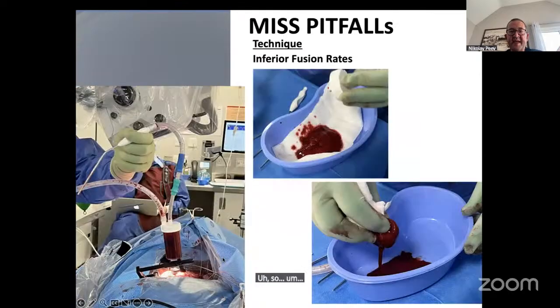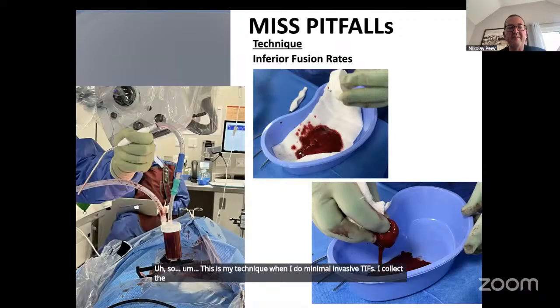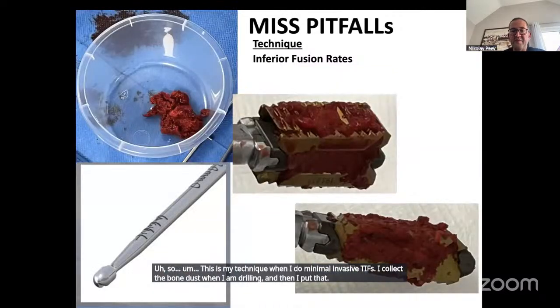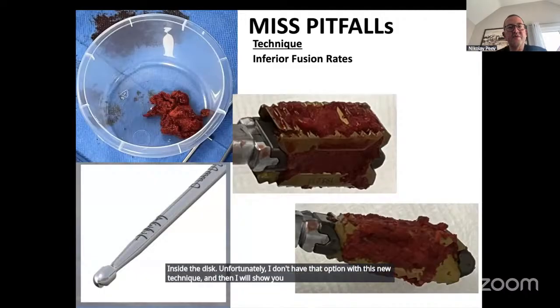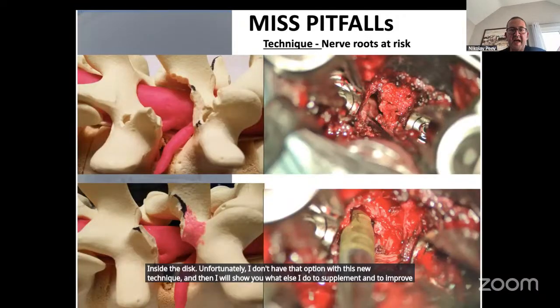This is my technique when I do minimal invasive TLIFs. I collect the bone dust when I am drilling, and then I put that inside the disc. Unfortunately, I don't have that option with this new technique, and I will show you what else I do to supplement and improve the fusion.